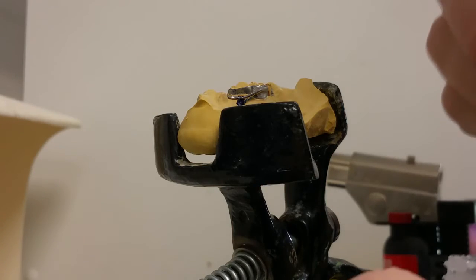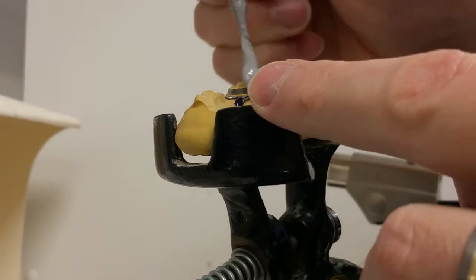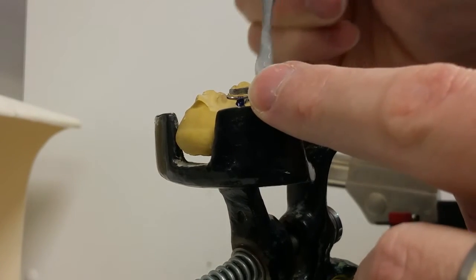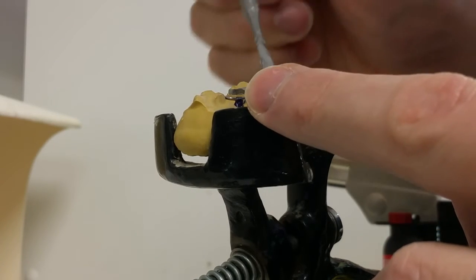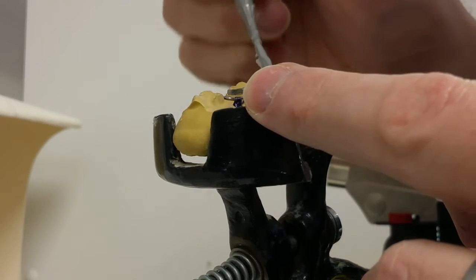You just keep doing the same thing. This is the next one. Just do the same thing: apply flux, apply heat shield, apply heat, and then solder.